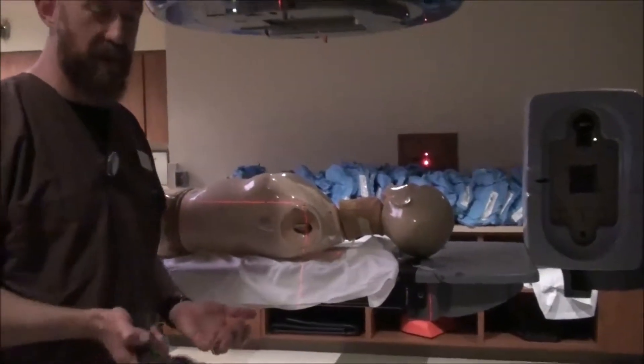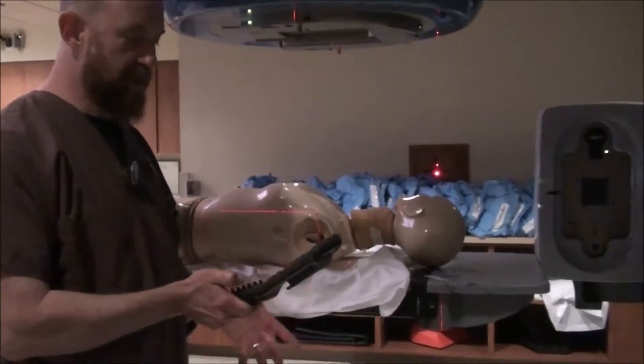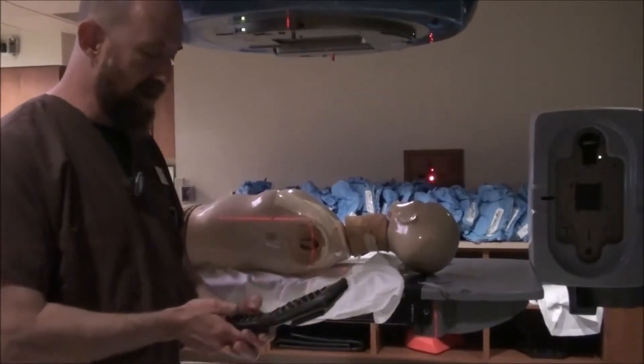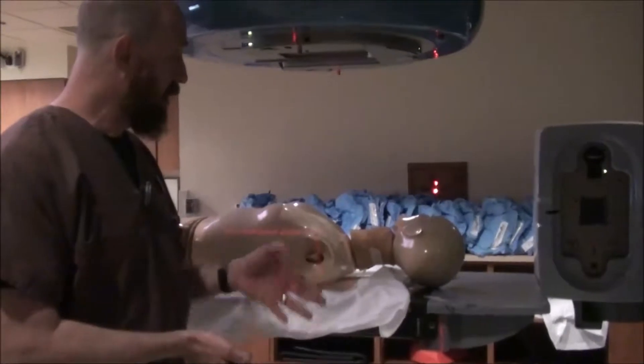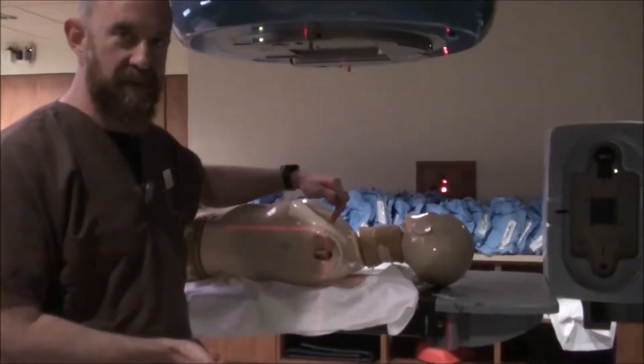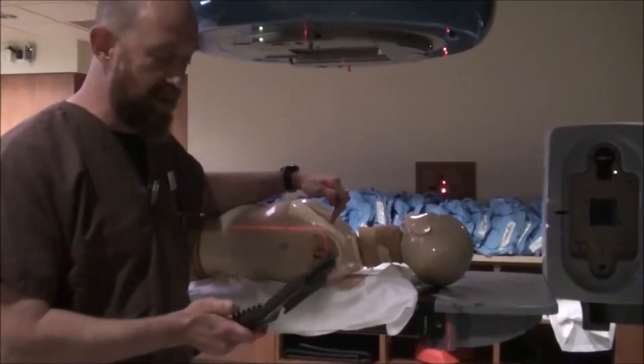Mono-isocentric breast simulation. Very similar to what we just did with the non-mono-isocentric. The only difference is once you have your isocenter set here, you're not going to move this patient again.